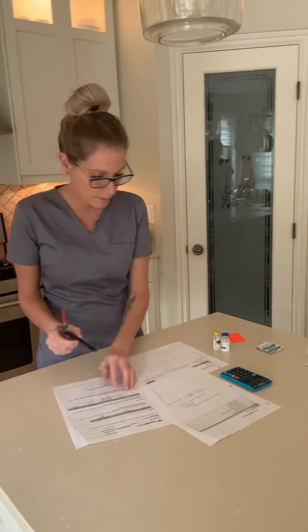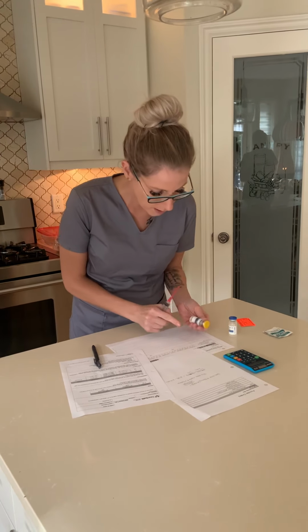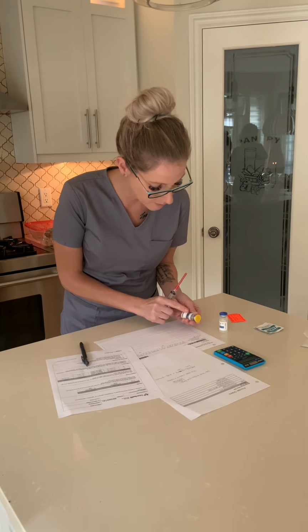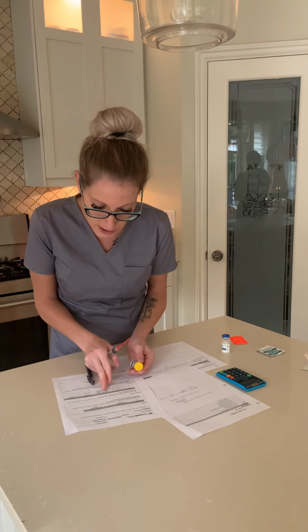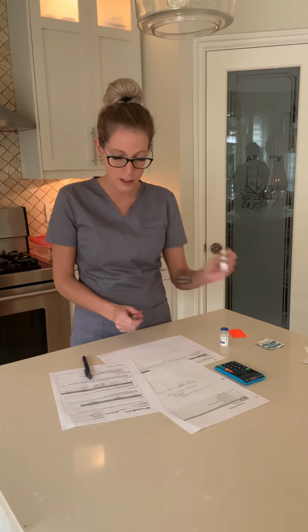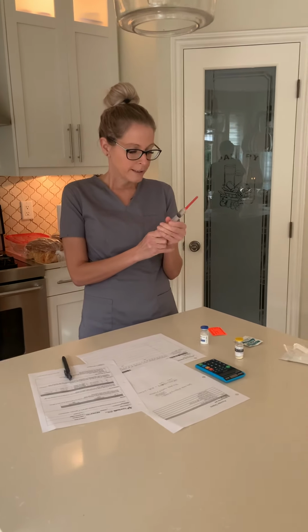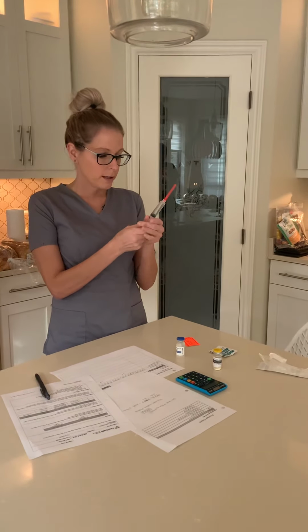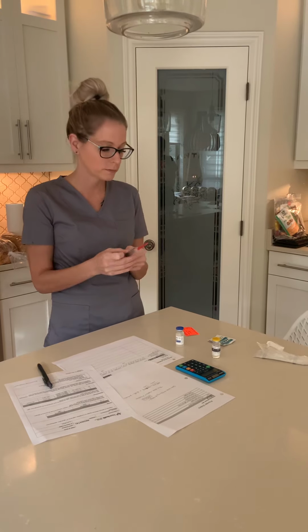I see that I have got the 1 gram. I've double checked everything. 1 gram, which is 1,000 milligrams. I'm going to add 9.6 sterile water for injection. So what I need to do is I'm going to loosen this off, and I'm going to draw back to allow for 9.6 mils of air.